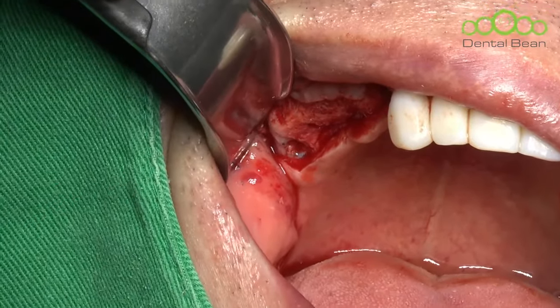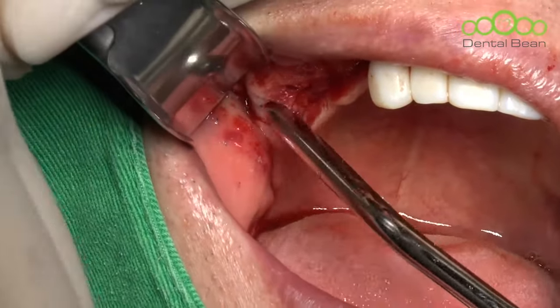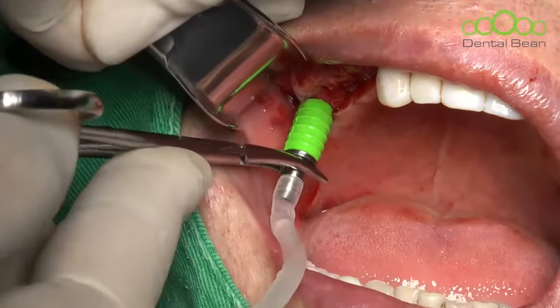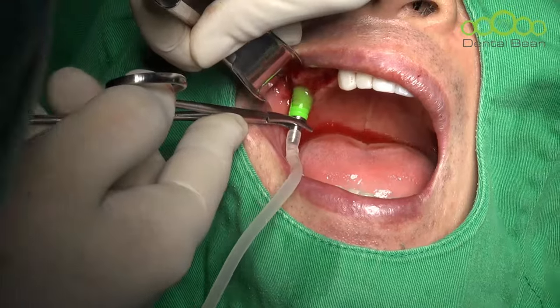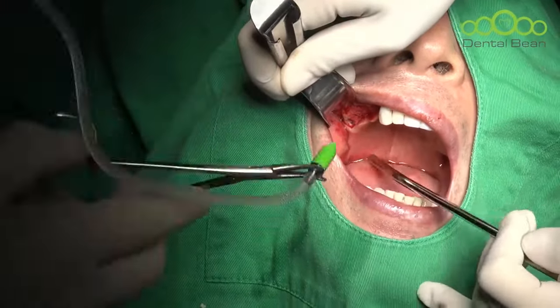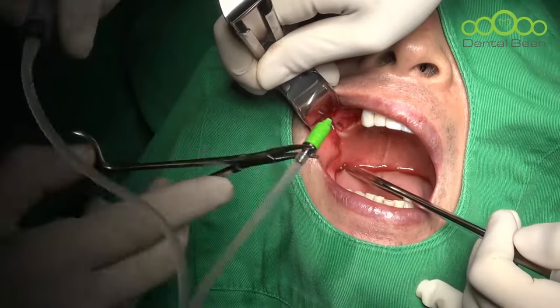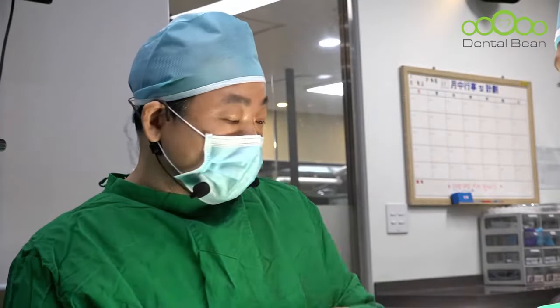Because I injected the saline sufficiently at the first trial, the membrane at number 7 was already slightly separated. Let's try hydrolifting. Maybe the saline will pass through the anterior hole, like this. Okay, one more. Let me show you. Like this. Okay, it is well done. So next, I'll try ridge splitting at the premolar site.